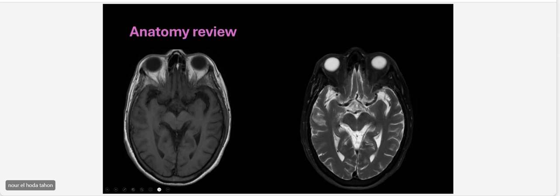This is part also of the lateral ventricle. You have the occipital horn of the lateral ventricle. So now you saw in the previous image the temporal horn, okay, and now this is the occipital horn of the lateral ventricle. And this is the midbrain. You can see it open like this, and this is the interpeduncular cistern.